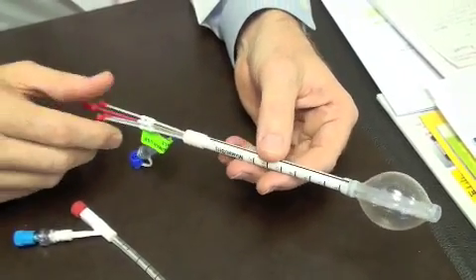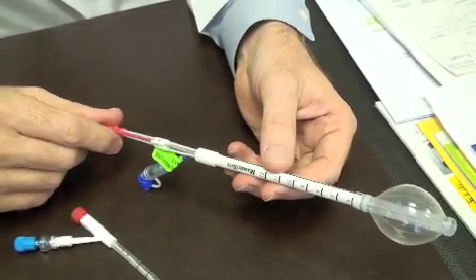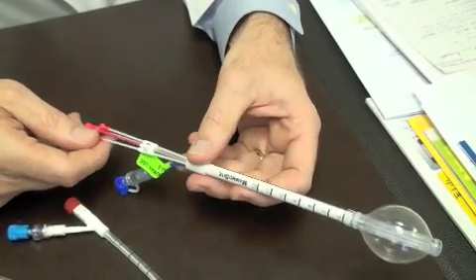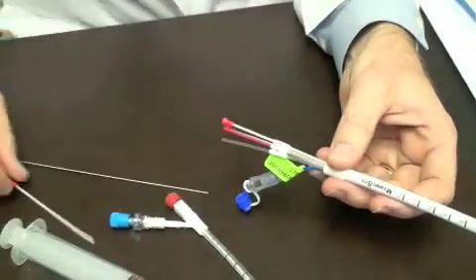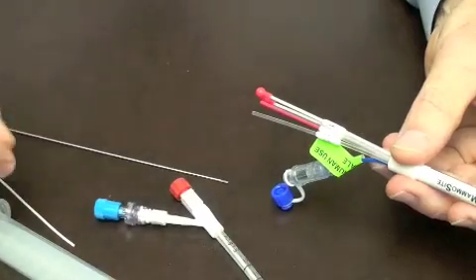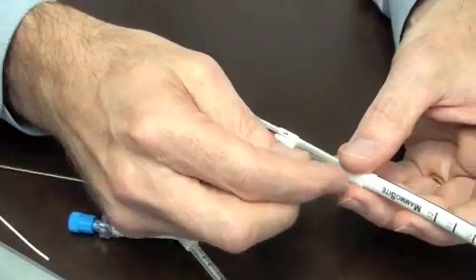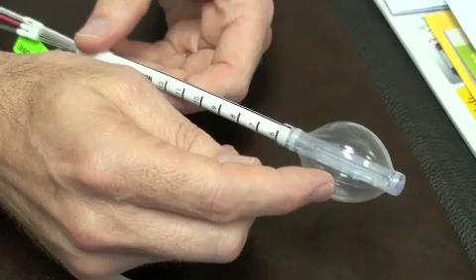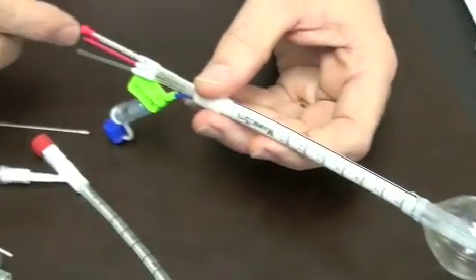Then the patient goes over to the radiation oncologist in the Focher Cancer Center. The patients are connected to an afterloader machine that connects to these small tubes. The machine automatically brings this little radiation pellet all the way down here to sit in the middle of the balloon for about 10 minutes total dose, and then it comes back out again.